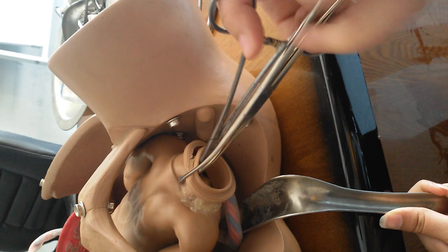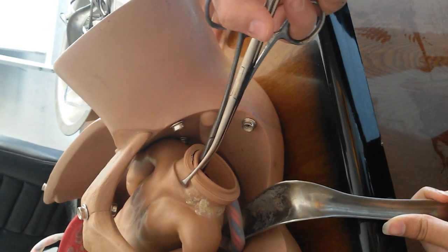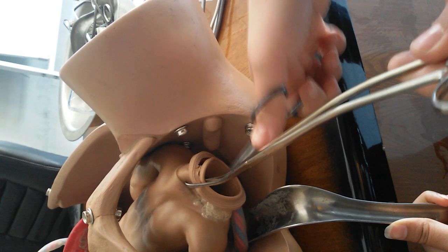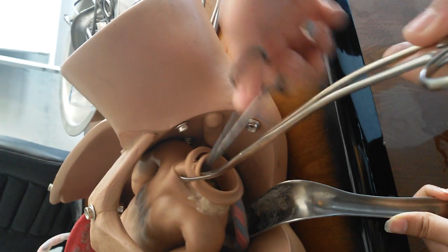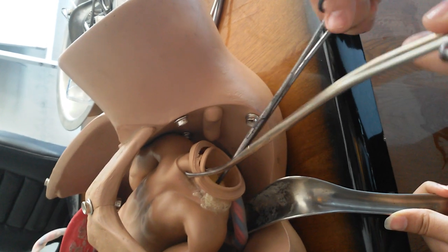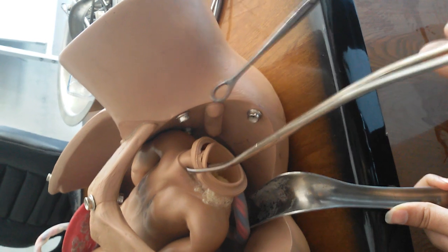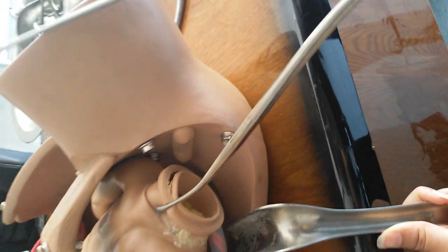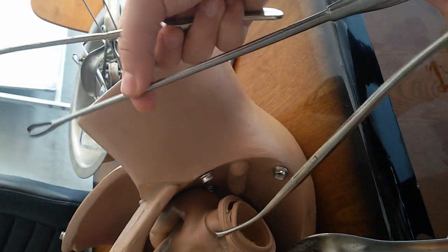We do not insert any instrument more than eight centimeters. After insertion of the sponge forceps, we move our hands in the appropriate direction, open and close to pull out large pieces of tissue, and continue until we see air bubbles in the os. After this, we take the curette, again comparing it to the sound — about eight centimeters.